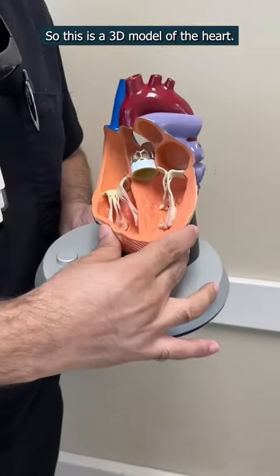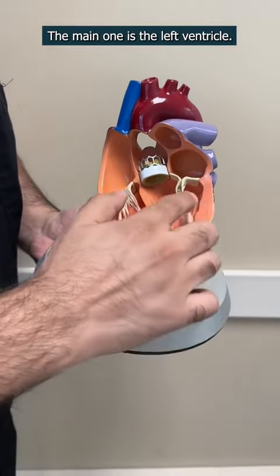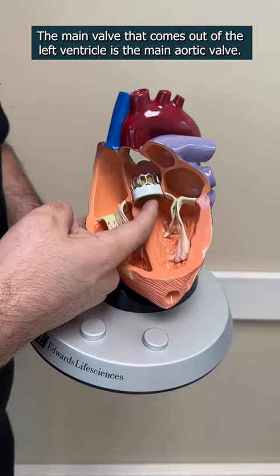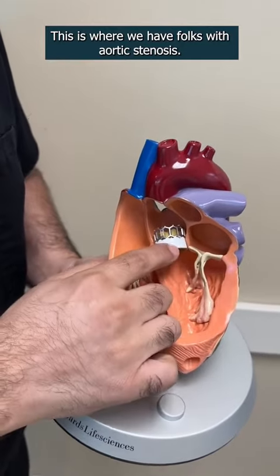So this is a 3D model of the heart, and we're going to show you what we're going to be doing today. The heart has 4 chambers. The main one is the left ventricle. This is the chamber. This is an inside look of it. The main valve that comes out of the left ventricle is the main aortic valve. This is where we have folks with aortic stenosis.